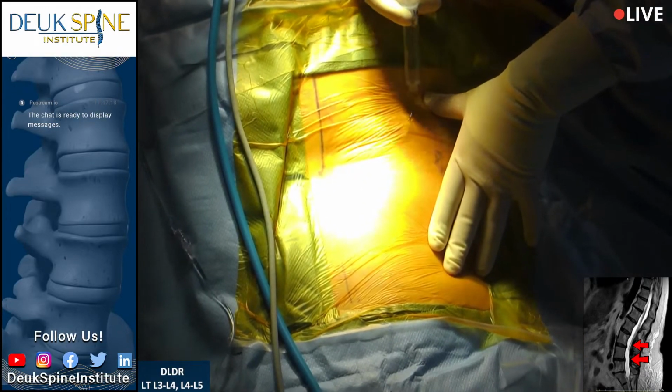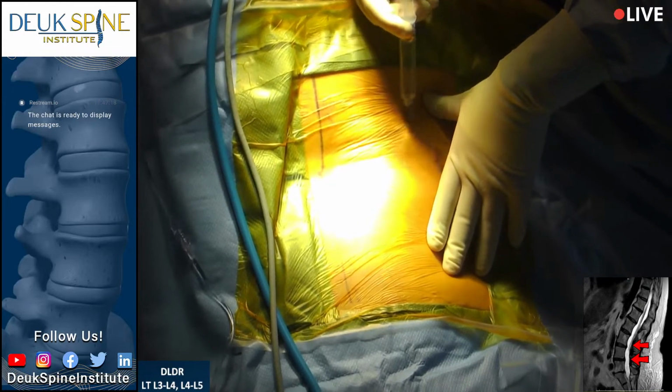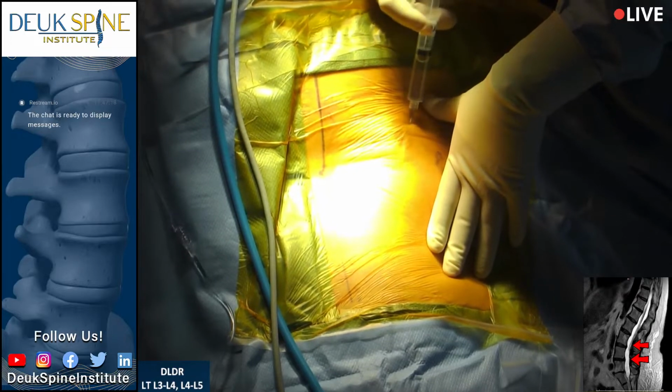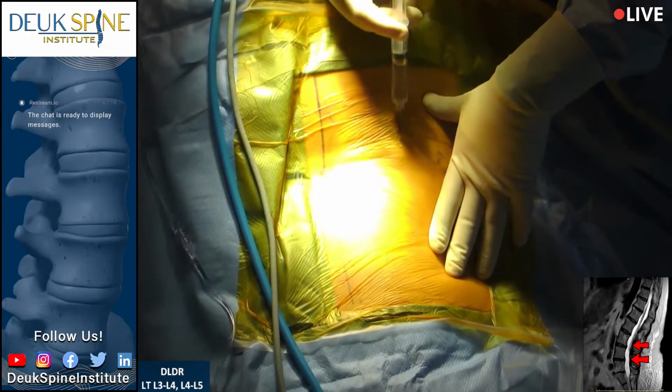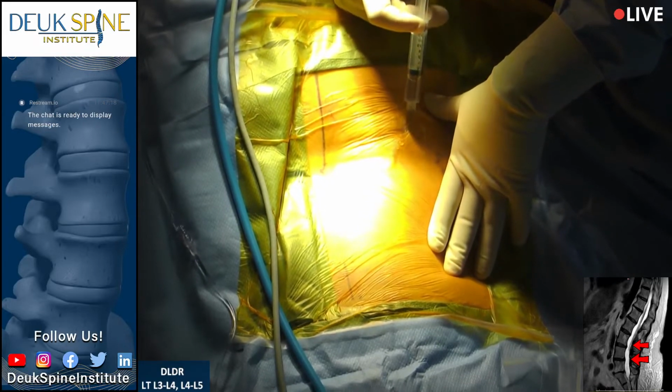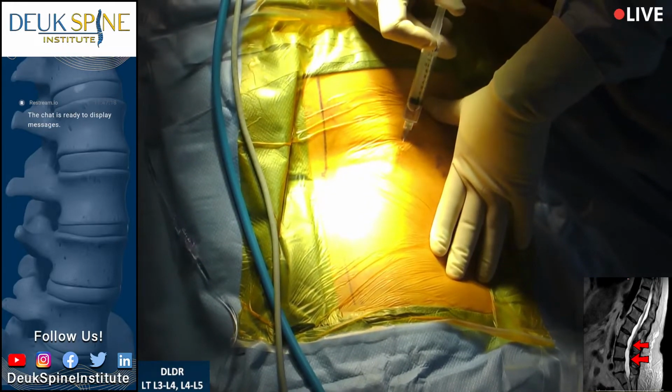Just lay still, giving you a little bit of numbing medicine. Well, just like at the dentist, nobody likes getting that needle stuck in their mouth to numb up their teeth. But, you know, it's a bit uncomfortable. But after a few minutes, it starts to feel a whole lot better. You're doing great.